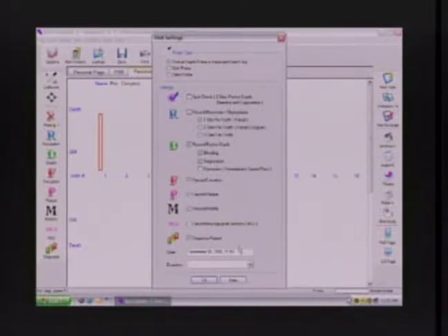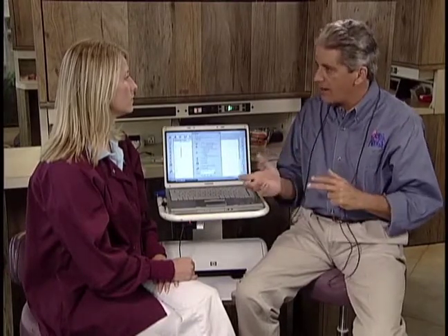We've date stamped the exam. Not only is that important for today's record, but Florida Probe maintains comparative data over time. It shows me instantly and graphically changes in pocket depth over time.